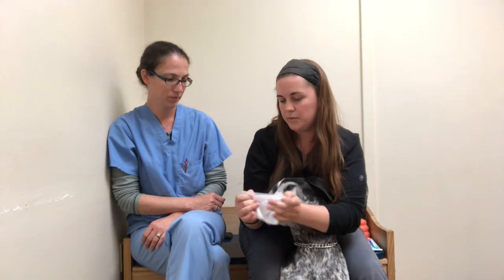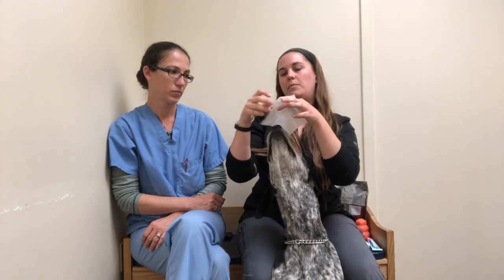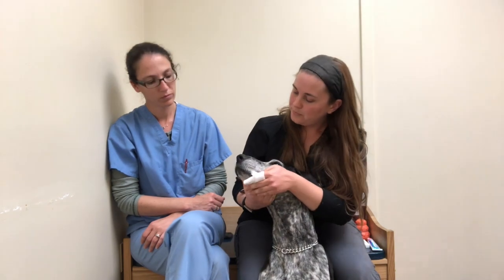What I like to do is start with just a plain piece of gauze, open it up and wrap it around my finger, and notice that I use a dry piece of gauze. I don't want anything on it, and I don't want it wet because it'll just slide right over what I'm trying to take off his teeth.